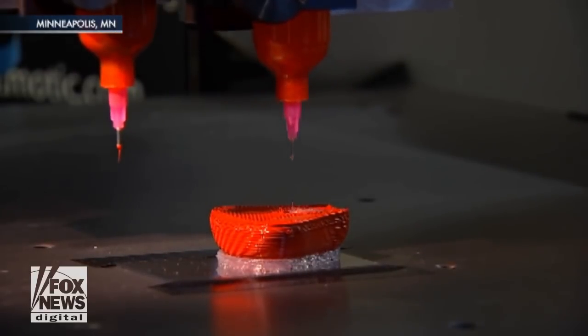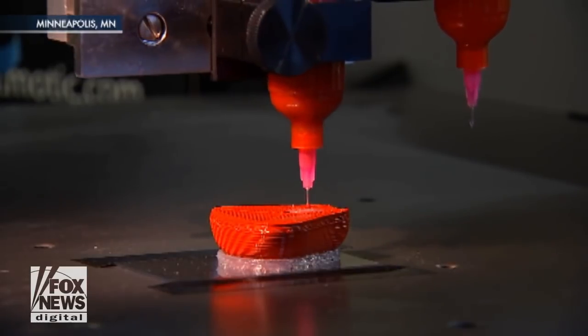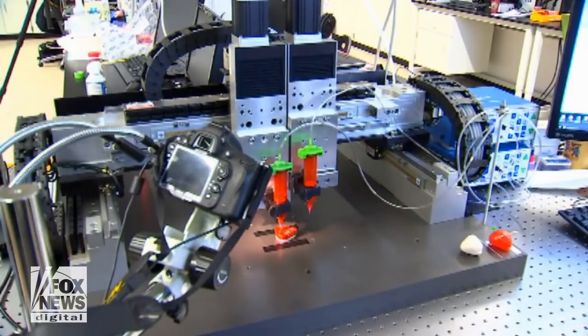We decided to start with a prostate model because the prostate is a relatively simple organ. Starting with a simple organ, although nothing about what this 3D printer is doing is simple.